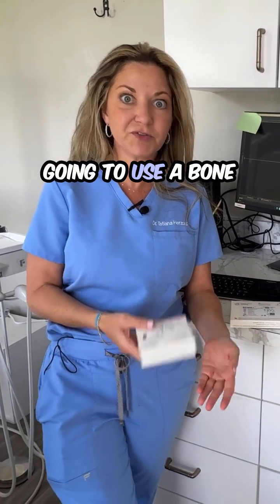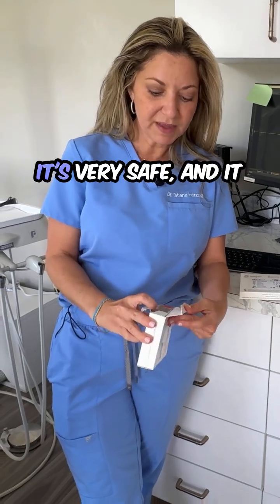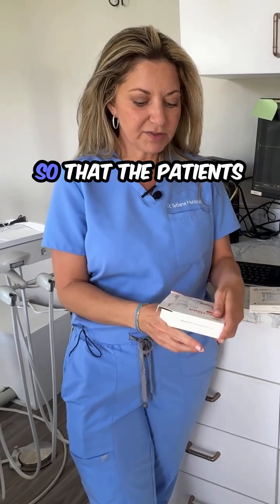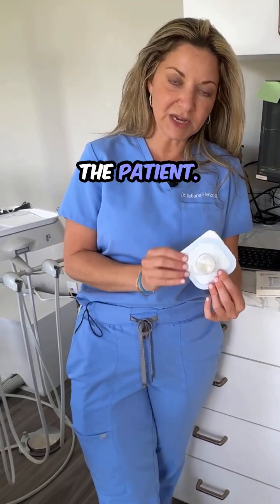During the procedure, we're going to use a bone graft material. The bone graft material comes in a box like this, and this is actually donor tissue, which means it's coming from a human. It's very safe, and it has been irradiated or sterilized so that the patients can use it. It's also been tested for a number of different diseases, so that we know that this won't transfer anything to the patient.